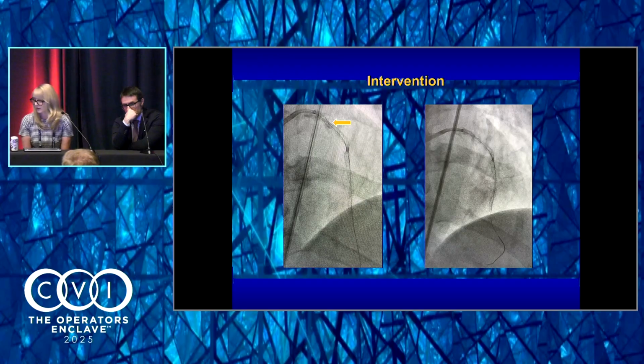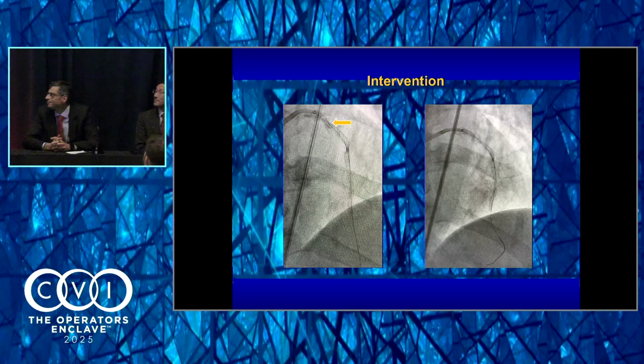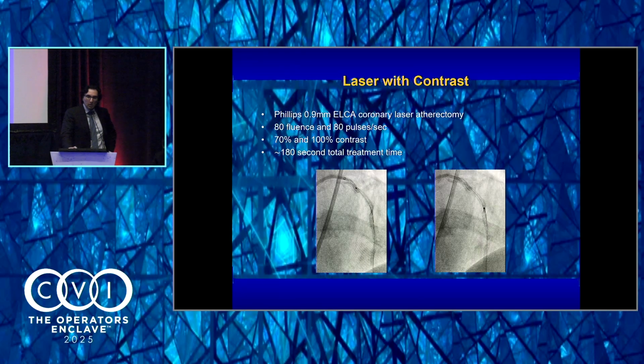And one thing to remember always in these cases, the first thing is check your wires actually didn't go under a stent strut, right? So always try to wire with a loop, because sometimes the wire goes under the struts, and that's why you cannot deliver. No, absolutely. And I tried all those things that I learned from Dr. Balakis' books, but I couldn't get anything across. So I went with a laser. Used a 0.9 millimeter laser.